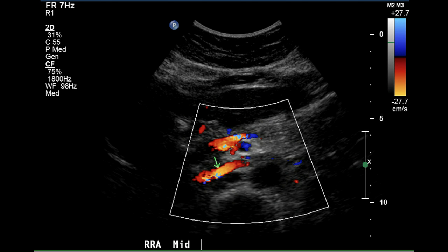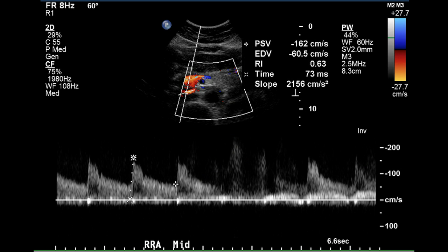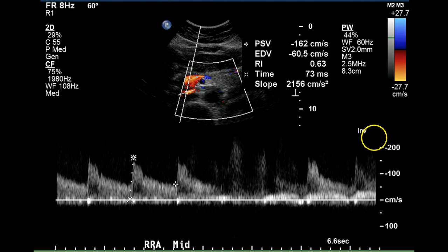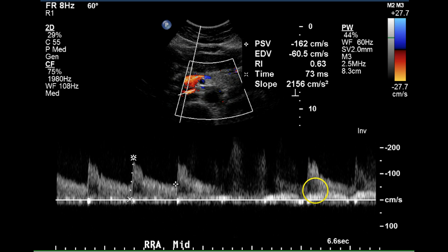The mid-portion of the right renal artery appears to be free of plaque and fills completely with color Doppler. The velocity is 162 centimeters per second with a very sharp upstroke. The acceleration time is 73 milliseconds and the resistive index is normal. The pre-dicrotic notch can be seen on this waveform, which is an indication of normalcy of flow.